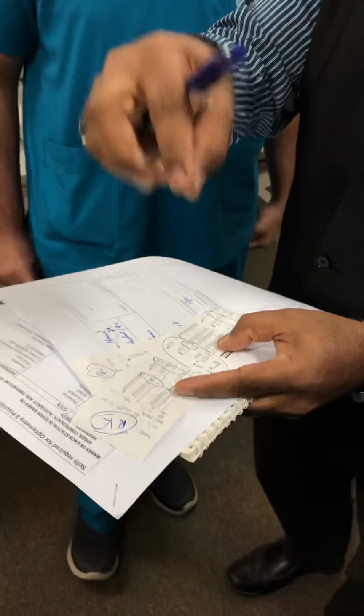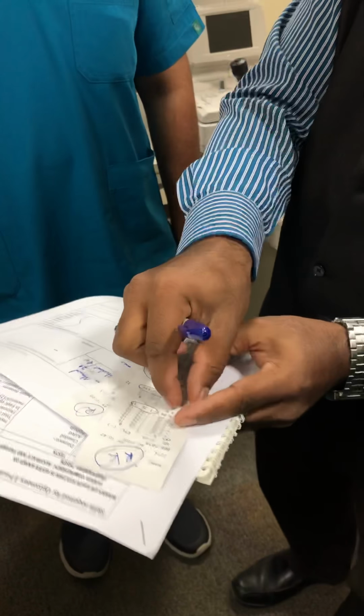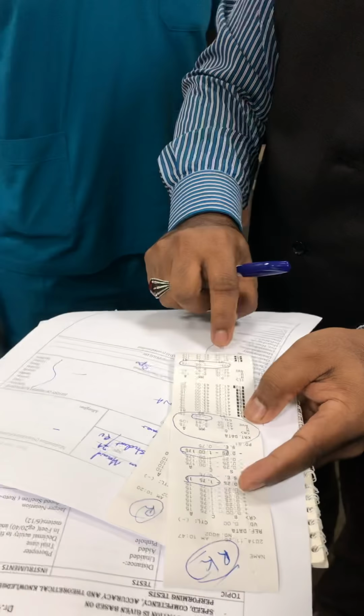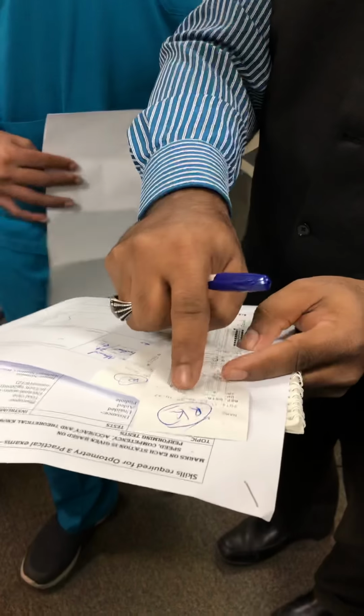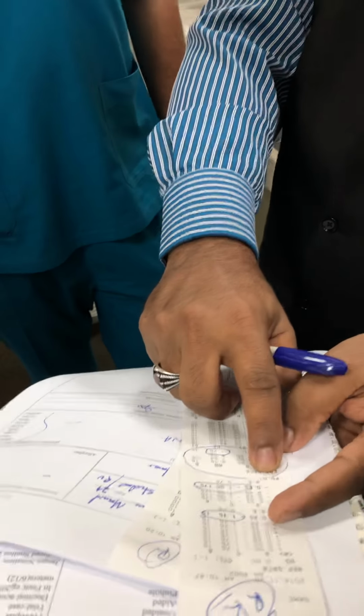So if anyone asks you this, you are supposed to know in and out of these details. You should know that it gives you sphere, cylinder and axis, right eye, left eye. It gives you the average value. It gives you the spherical equivalent. It gives you the date and all the things, and even the pupil distance also. So that's what it tells you about the objective refraction.